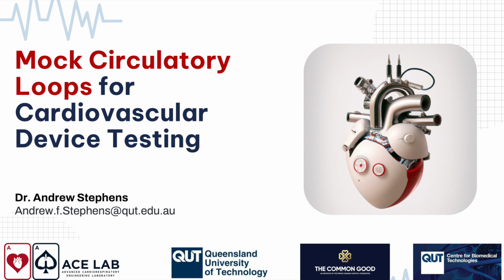Whereas if you were interested in, say, developing control systems, your validation might focus around the repeatability and response of your mock loop. So how long does it take to change between two states? What's the overshoot, settling time, repeatability coefficients? You should validate based on what you're specifically looking at. That's good advice for building the mock loop too.